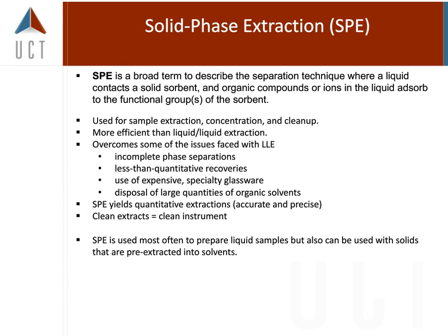So solid phase extraction is something that was introduced and worked on a long time with United Chemical Technologies, and a long time ago someone said they're going to teach me a lot of this, and absolutely, I've learned more about solid phase working with Mike Telepchik and UCT in the last 10 years than I ever thought I would.